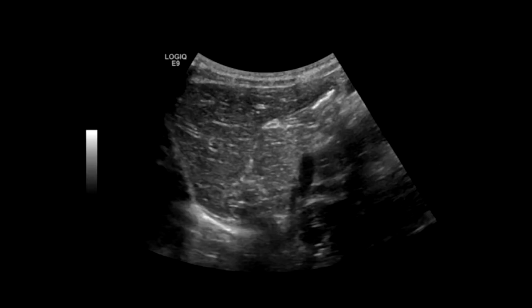Hey there everybody. I just wanted to make a quick video going over the protocol of the liver. I'll begin with the normal views and then I'll go over some of the anatomy as I'm going through.